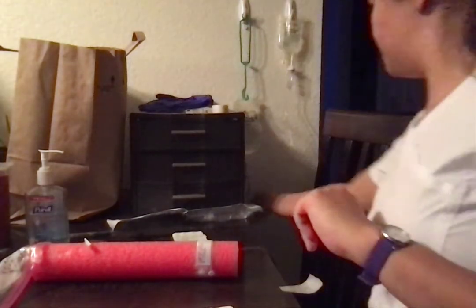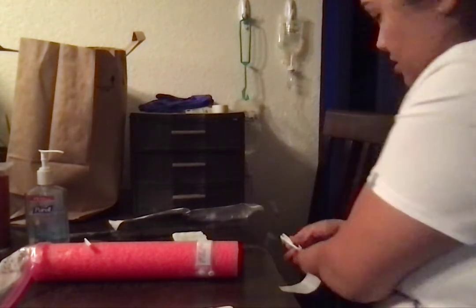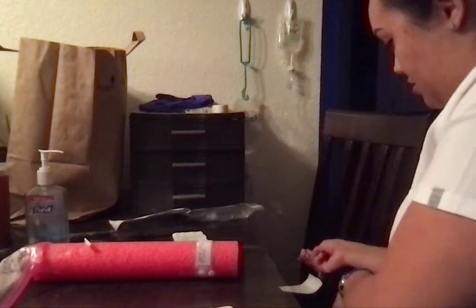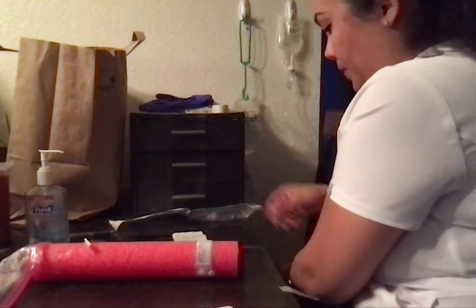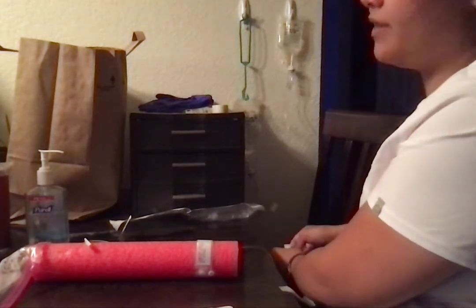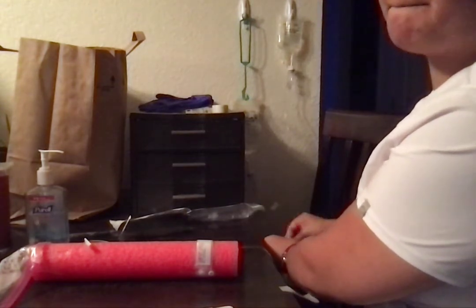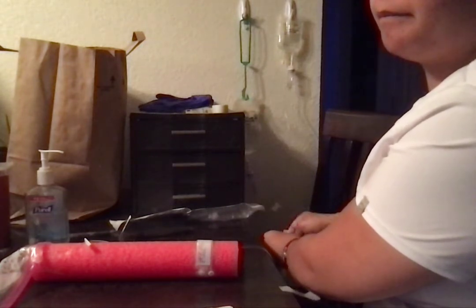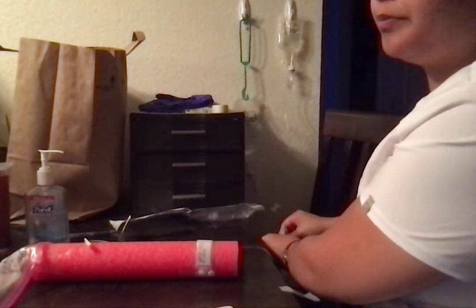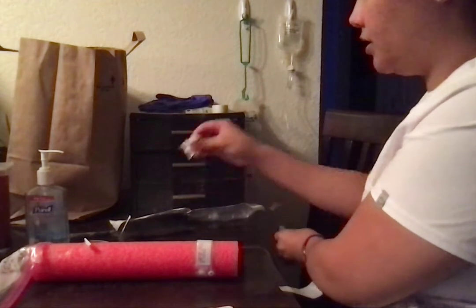We're going to make sure that the main line is clamped shut. Okay, so that's not running anymore. And then I'm going to use an alcohol wipe and cleanse that vigorously for 5 to 10 seconds. Okay, that's good.